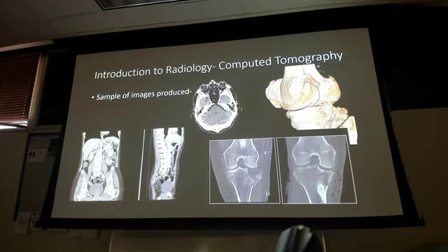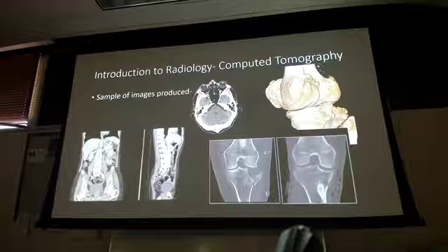We'll get to a slide where it talks about the different planes, but you will have to know what planes and what we're looking at from all these different views. But we got the head CT up there, so that's going to be an axial slice. We look at how nice we can see the brain tissue. I can't necessarily make out gray and white matter very well, and that's okay. But when we get to the head CT portion, you will be able to pull out bleeds, and that's the biggest thing, being able to pull out acute bleeds when you're doing trauma.